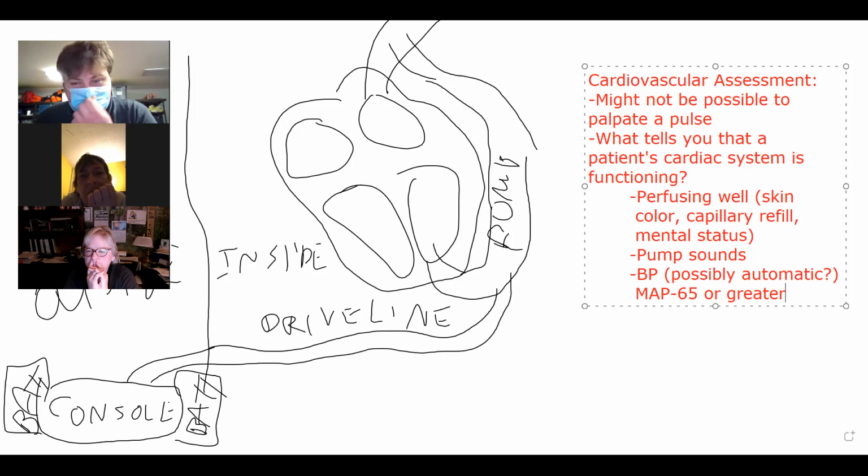Every person who has a ventricular assist device is sent home with a binder of information, and that includes the contact information for the VAD coordinator, who is a medically trained professional who can be consulted for ongoing care and to help you troubleshoot issues that don't fall into a logical pattern. And that might be one of those things where you would consider doing that. And they're on call 24/7. So it's easy enough to place a call to them.